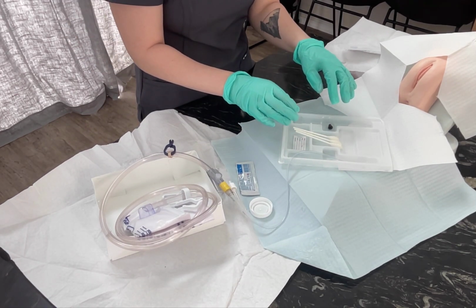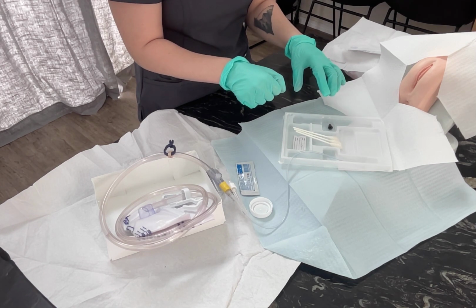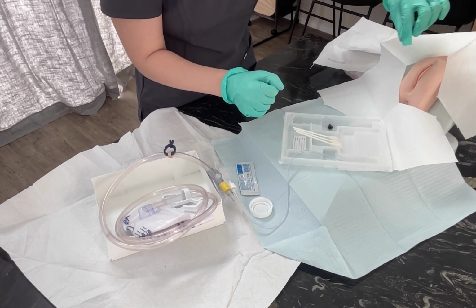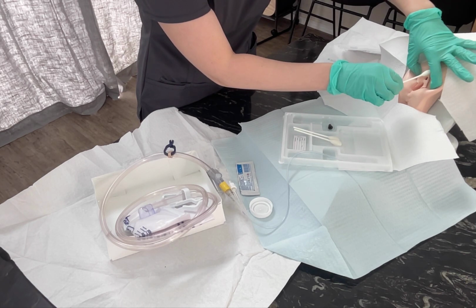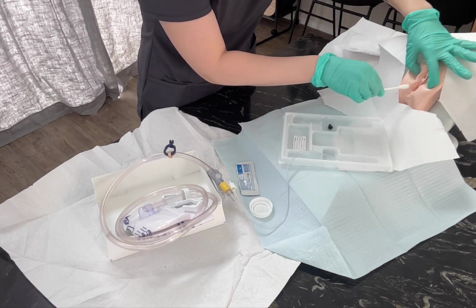So what I'm gonna do is part your labia, and then clean with 3 different swabs. And then I'm gonna have you take a deep breath, and then on the exhale, I'm gonna begin inserting the catheter. Does that work for you? All right, perfect. So now this hand is non-sterile. I would begin by cleaning furthest away from me, closest towards me, and straight down the center.